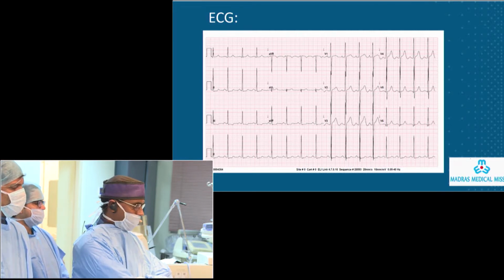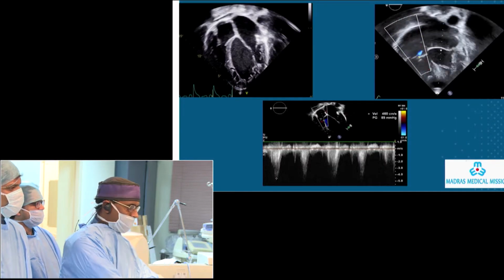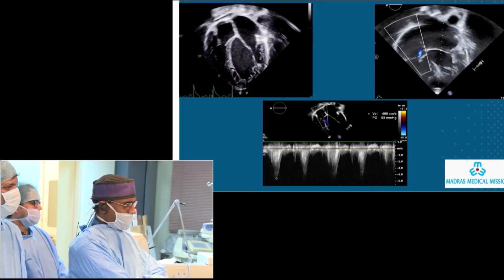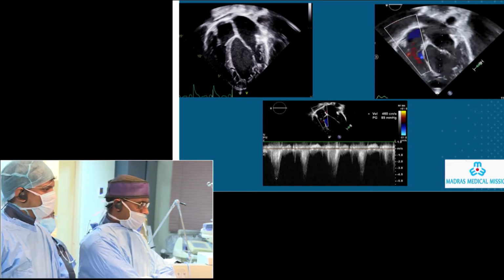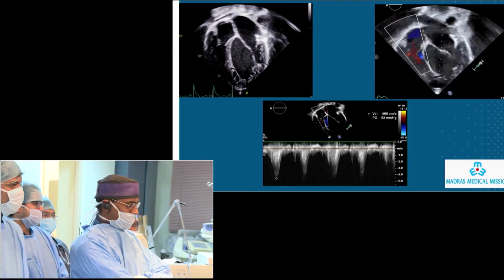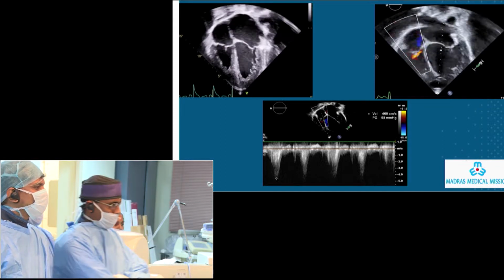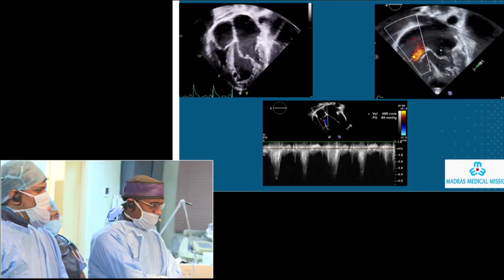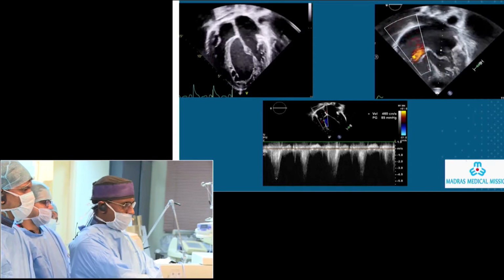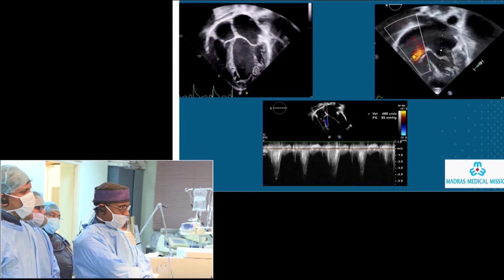Echocardiogram showed clearly, next slide, LA and LV dilatation. There was some amount of non-compaction of the left ventricle. Can you click on that first movie also? So there was a milder degree of non-compaction of the left ventricle. However, the ventricular systolic contractility was normal. There was severe pulmonary hypertension by the mild TR jet.